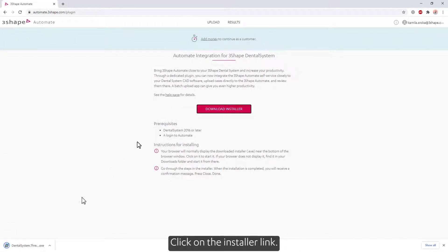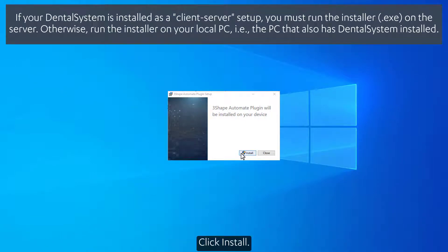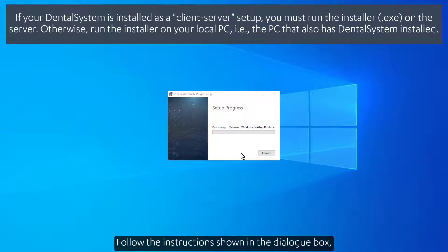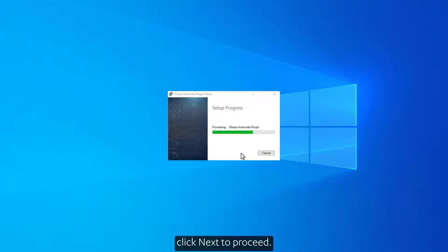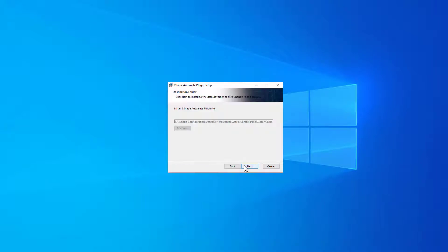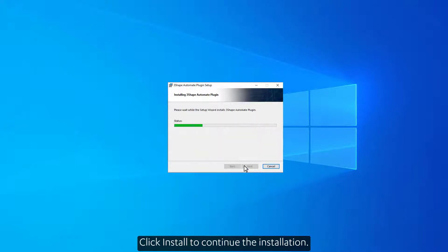Click on the Installer link. The 3Shape Automate plug-in setup will appear. Click Install. Follow the instructions shown in the dialog box. Click Next to proceed. Click Install to continue the installation.